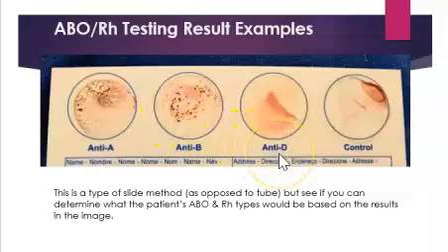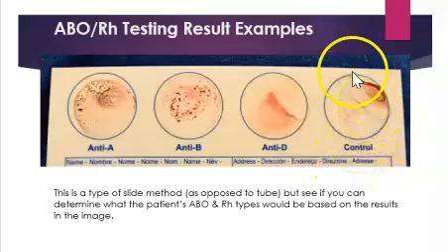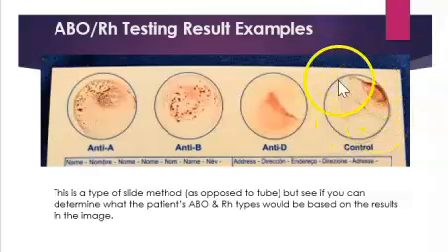Well, our anti-D reagent, again, we're looking for the Rh factor. This looks nice and smooth. I don't see any clumping. Also, we're looking at our control. Remember, we run the anti-D and the control for the Rh testing. Your control for the anti-D or Rh should always be negative, so it should always be nice and smooth. If it's not, then there's a problem with your testing.